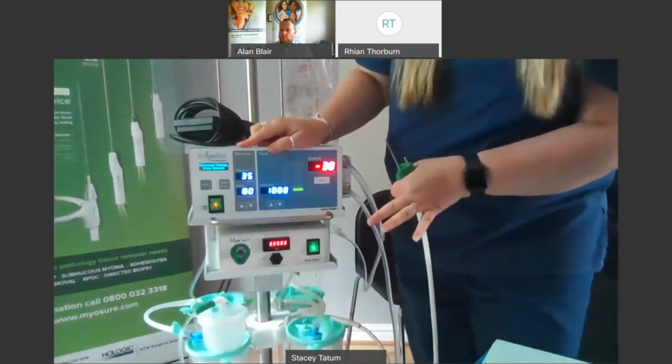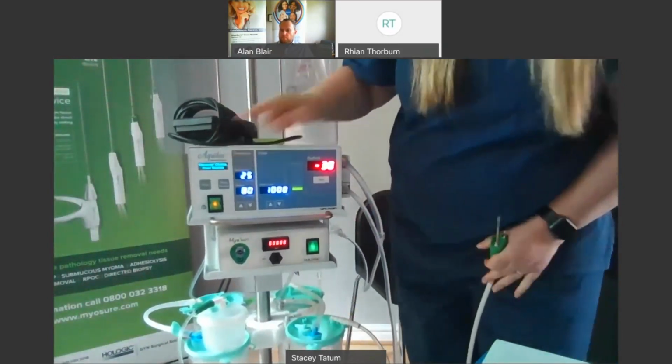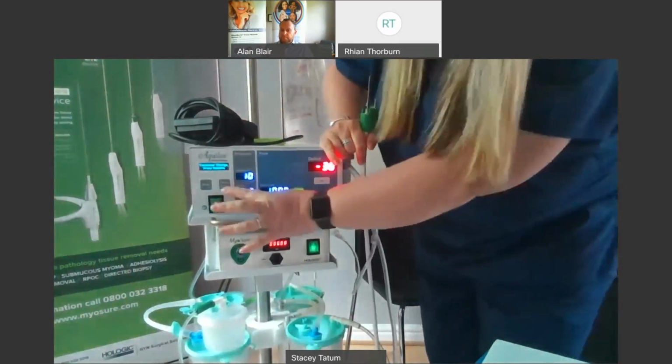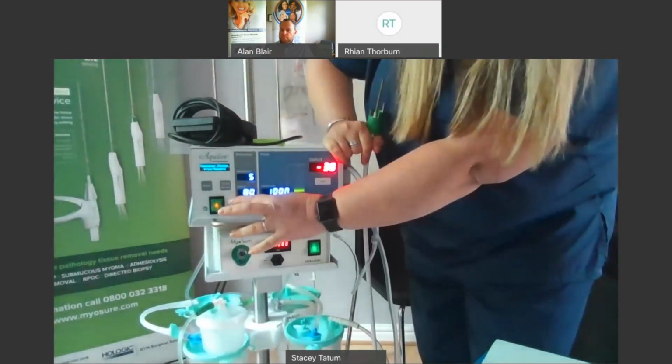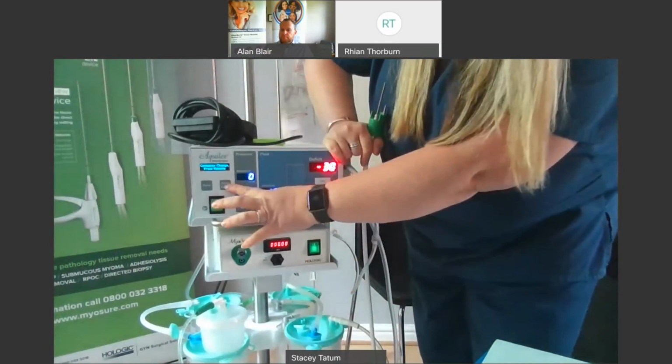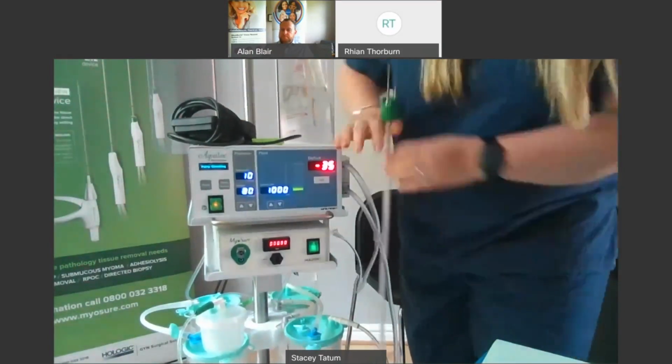Now, as soon as I put weight on the scale, it has paused because it thinks I'm going to change one of the canisters. That's normal, that's fine. I just need to make the surgeon aware that I'm about to do that because it will stop fluid going in as well. But all I need to do to start it is press the resume key.